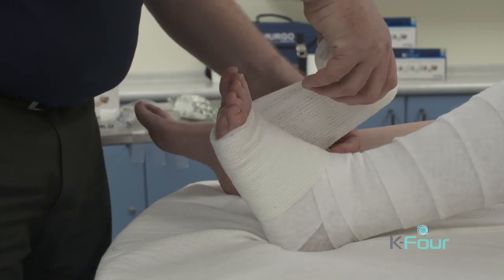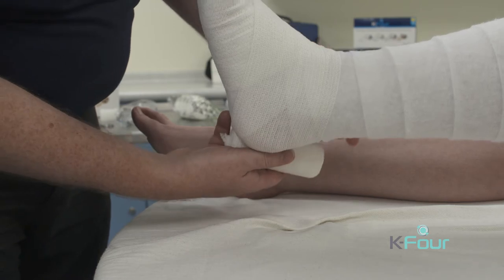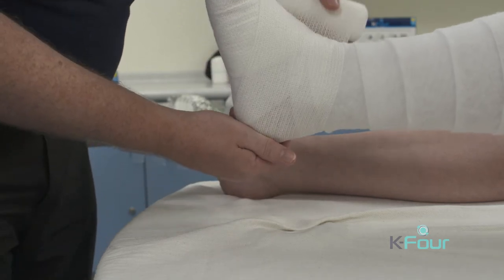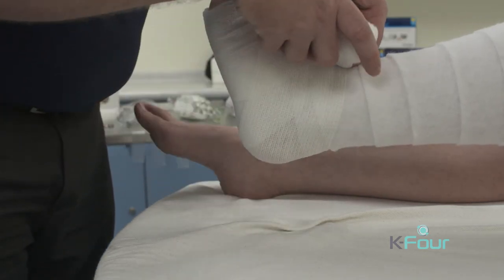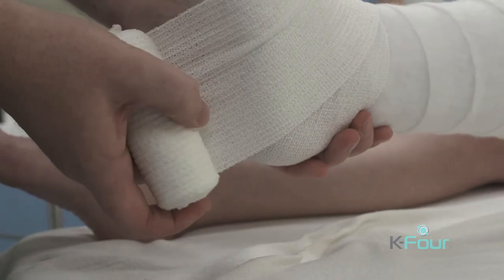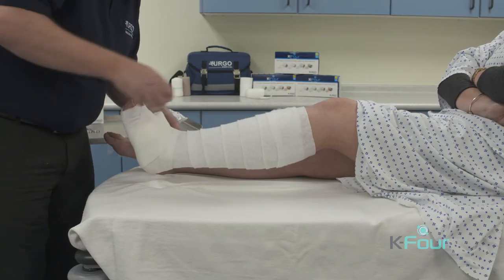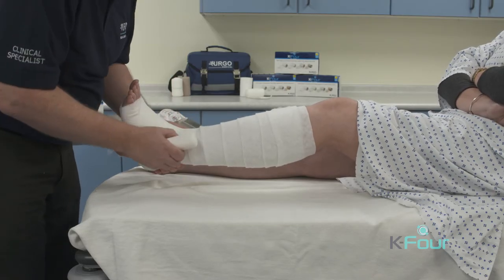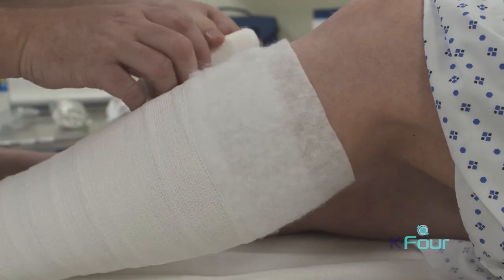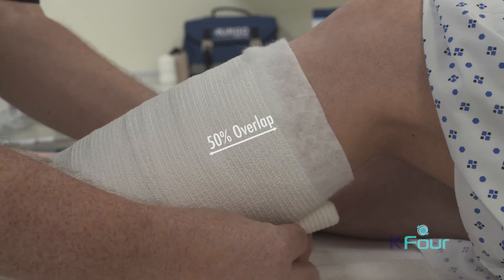Take it around the foot and start the ankle lock here. Over the top of the foot, close the window underneath and then lightly roll the bandage with enough tension so that it grips the limb. This should be applied at a 50% overlap to ensure that two layers of K-Lite are gained.